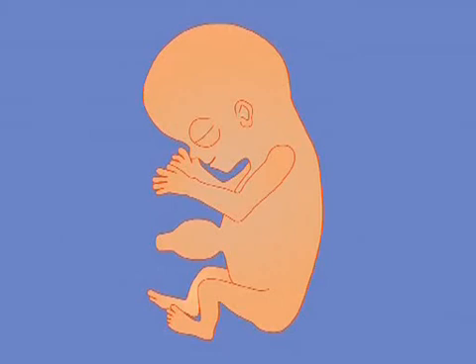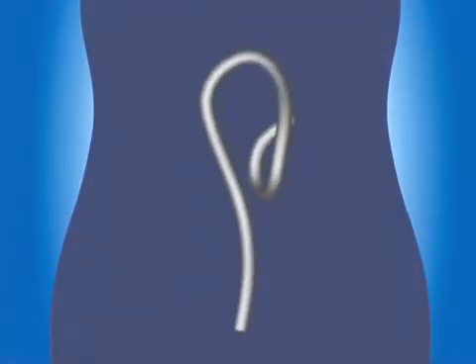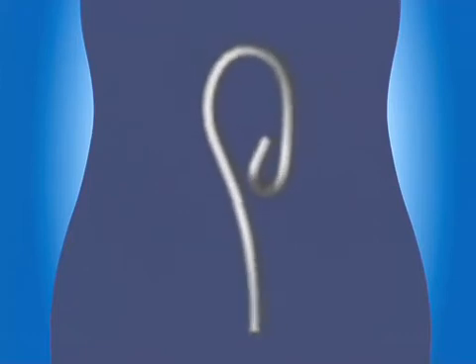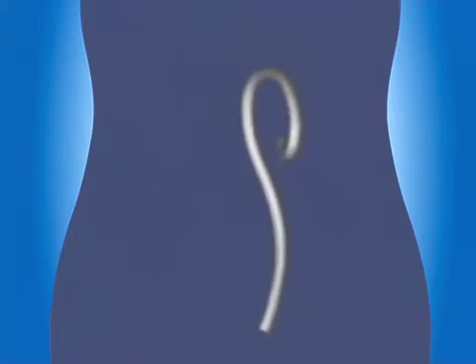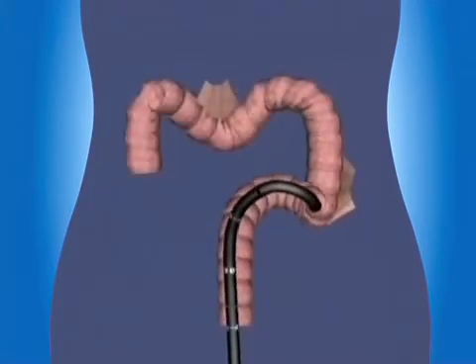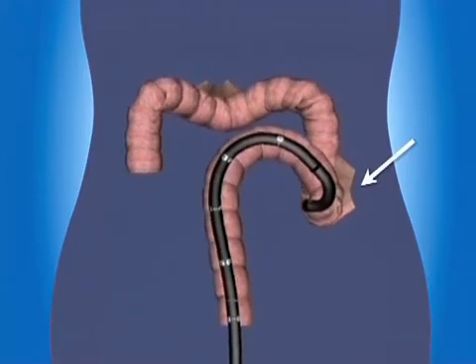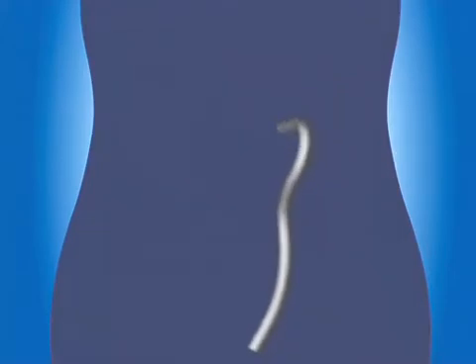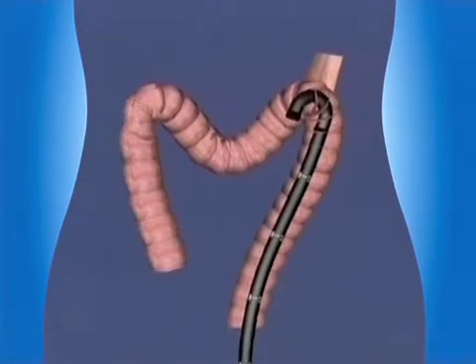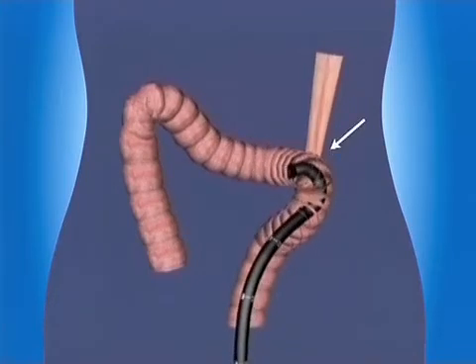Embryology may explain some of the mysteries of colonoscopy. It's no secret to colonoscopists that the colon can be very long indeed. This 3D imager recording shows the atypical loops and angulations that form, here at the sigmoid descending colon junction, due to a descending mesocolon. The endoscopist straightens this out, but see how the splenic flexure pulls right down, because the splenic flexure is mobile on a lax phrenicocolic ligament.